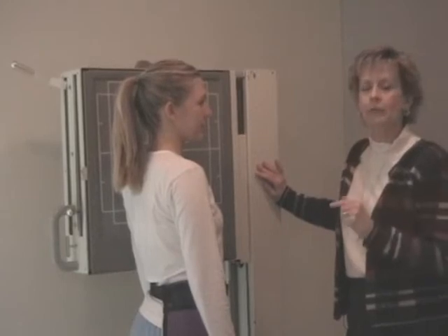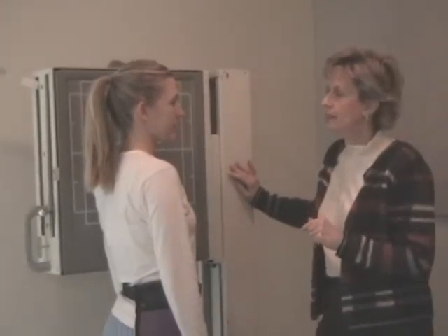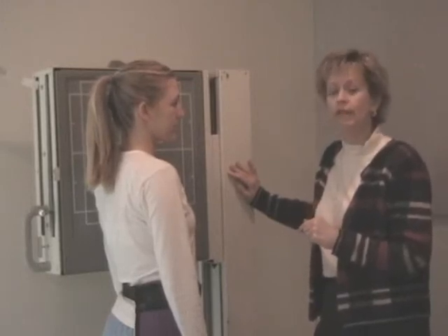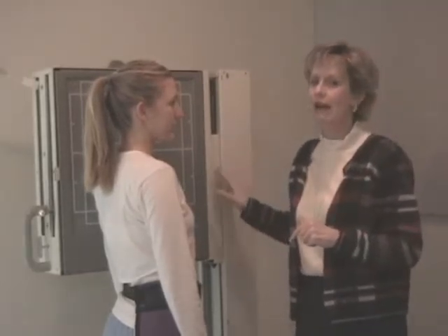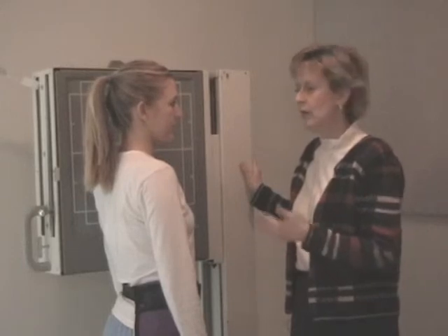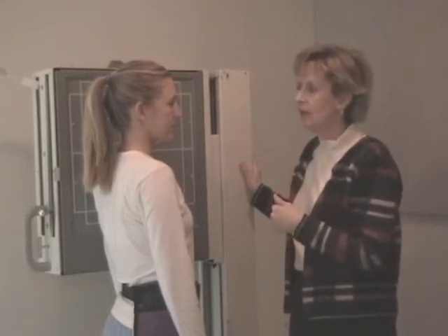Make sure you practice with glasses not on the patient. Glasses wouldn't be in the cervical spine region, but they will definitely show up on your image, this little metal frame and then these ears coming back, and you'll get laughed at. So remove the structures. Hair is not normally in a ponytail. That will cause you a problem, but for demonstration purposes today, she's elevated her hair for us so you can see her neck.